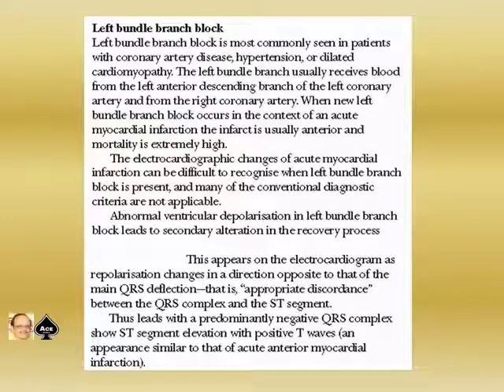The electrocardiographic changes of acute myocardial infarction can be difficult to recognize when left bundle branch block is present, and many of the conventional diagnostic criteria are not applicable. Abnormal ventricular depolarization in left bundle branch block leads to secondary alteration in the recovery process.